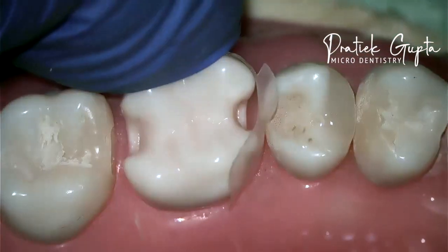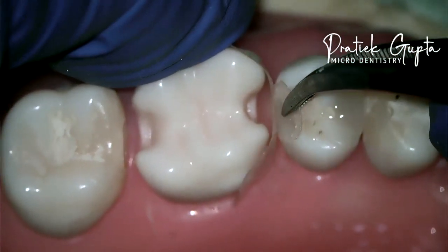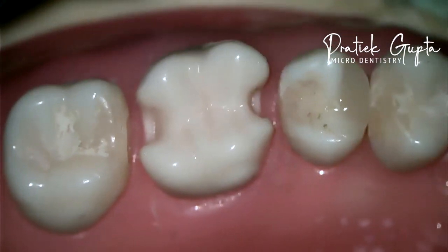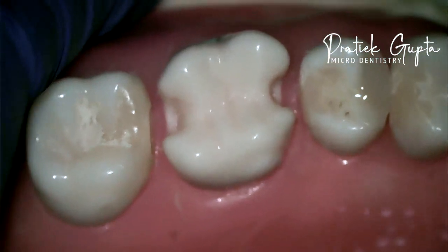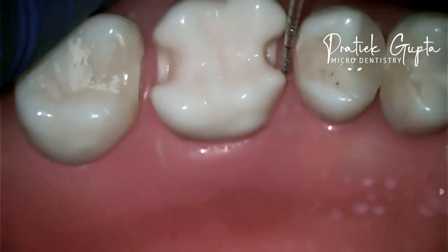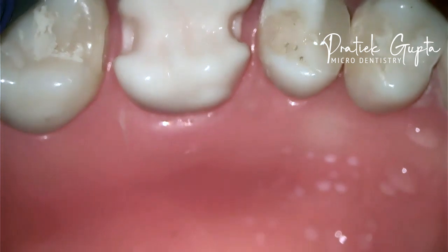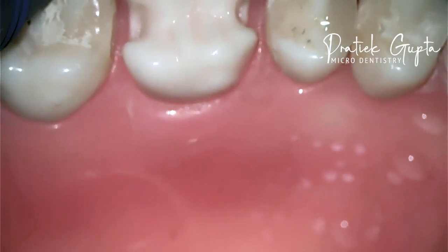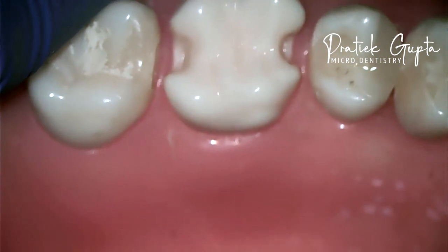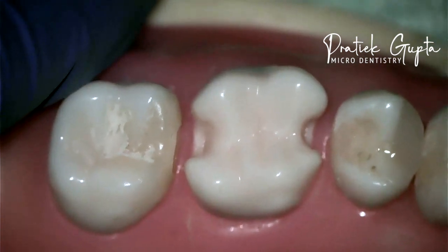That's why in this case, the 5.5 HD or the 5.5 Bio Blue — whichever you like — would be the ideal matrix. Now, imagine if the probe had read 4 millimeters, then I would have selected the 4.5 matrix. If the probe had read above 5, approximately 6 millimeters, then I would have selected the 6.5 HD matrix. So that's what the three heights of the matrices mean, and that's how we decide which matrix to use where.